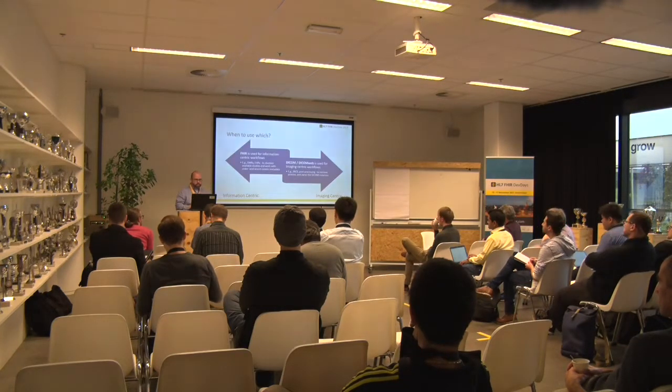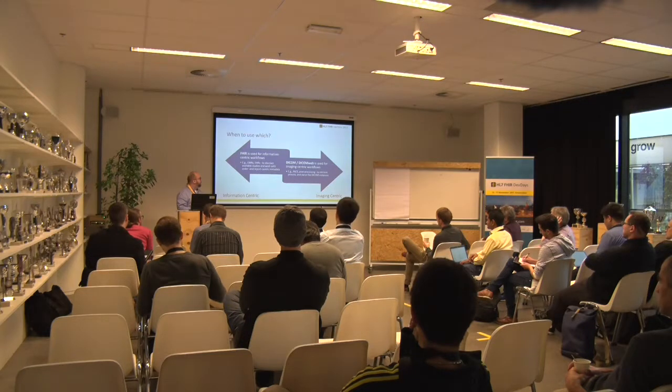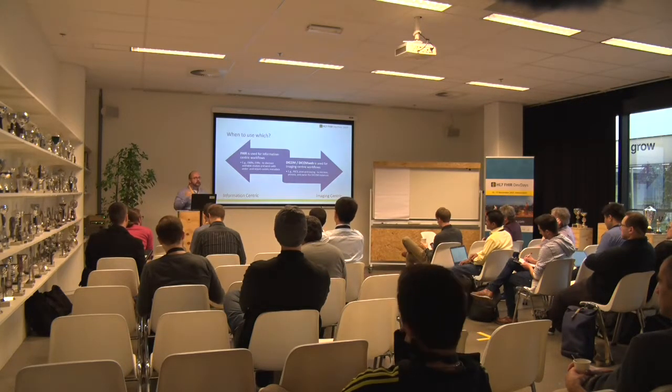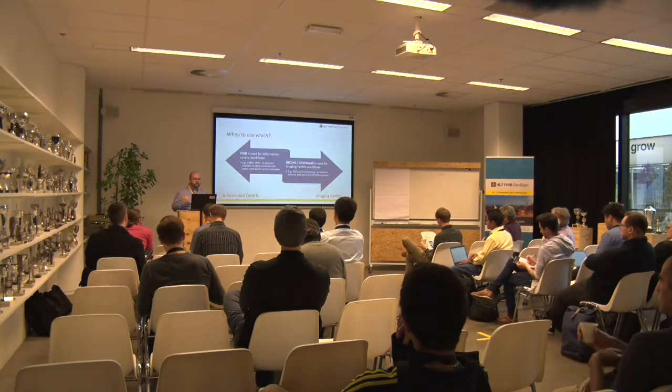So when we use FHIR versus when we use DICOM and DICOMweb, FHIR is geared towards information-centric workflows. So your EMRs or EHRs really, to discover the existence of studies and work with all the supplementary data like orders and reports around that. And we use DICOM and DICOMweb when we're looking at the imaging-centric workflows.